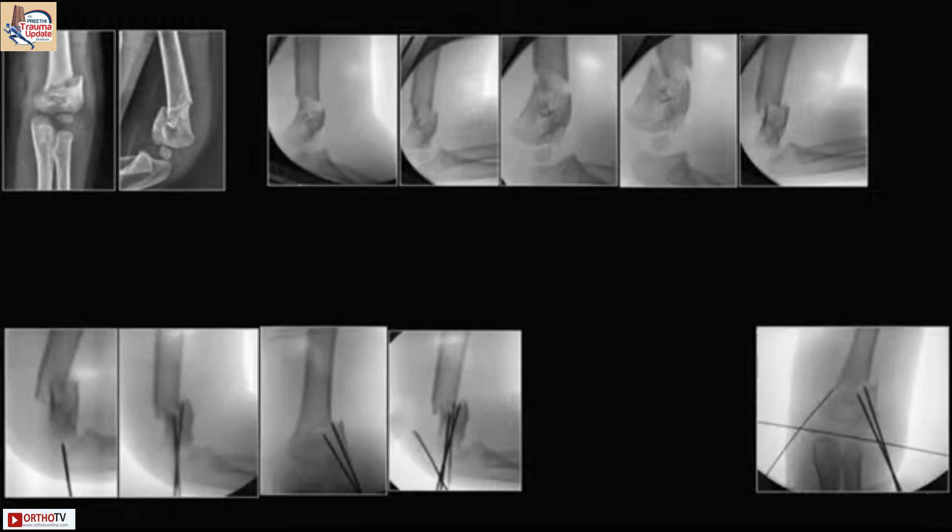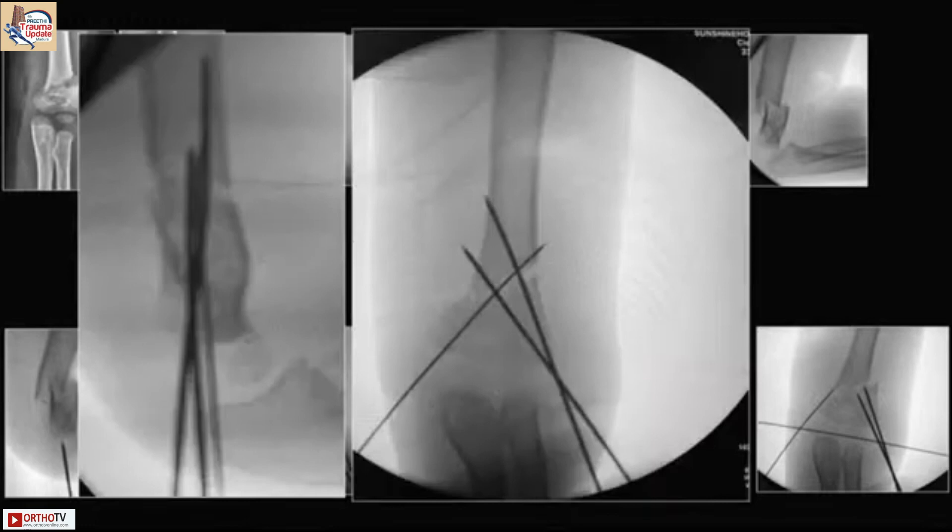I know you will all critique this, but I will show you again. This is the end result of closed reduction we obtained. However, there is cubitus varus. Probably if the olecranon pin had been maneuvered before pinning the medial and lateral sides, we would have gotten a better result.